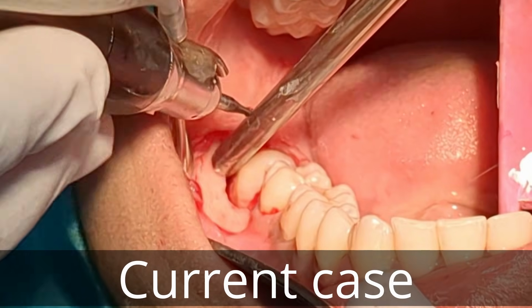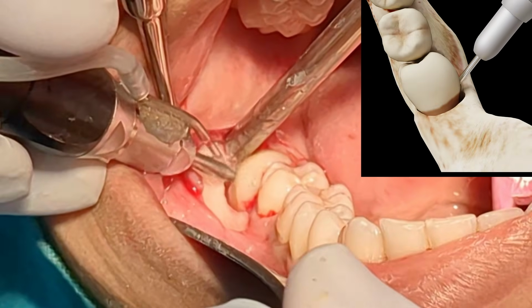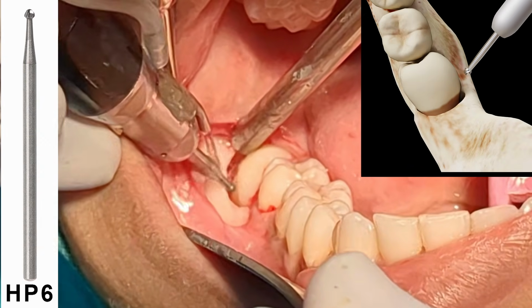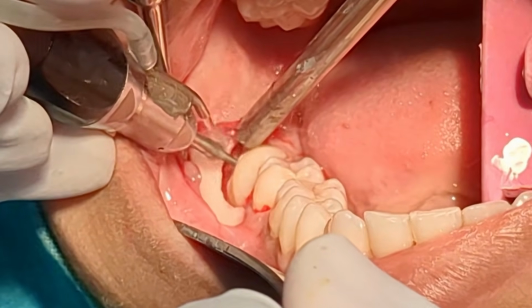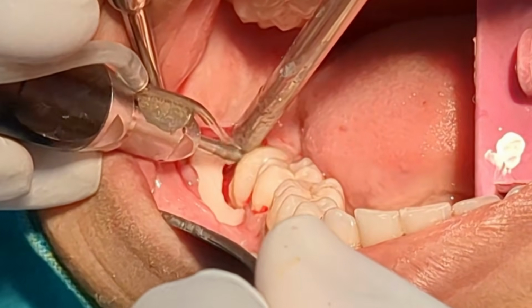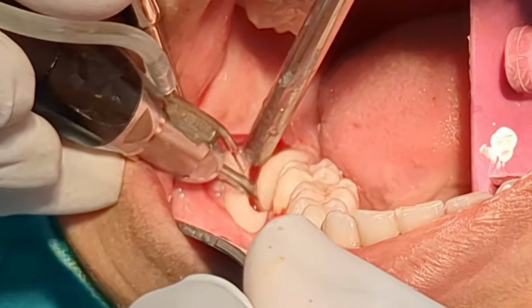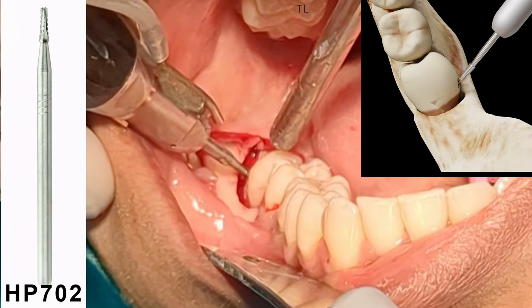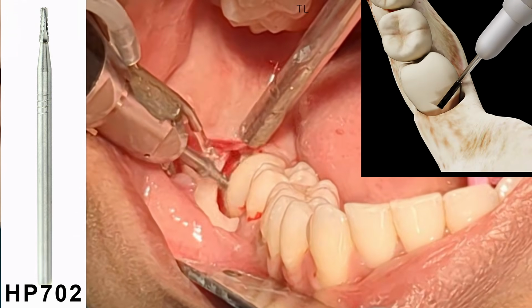So coming back to the actual surgery, after bone guttering, I place ditches in the tooth at the CEJ level using an HP6 round burr. Then with the 702 burr, I connect the ditches and create the section in the buccal half of the tooth.